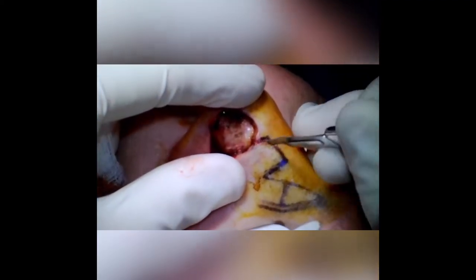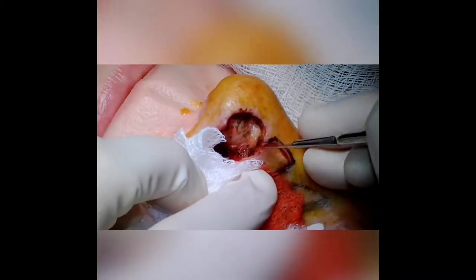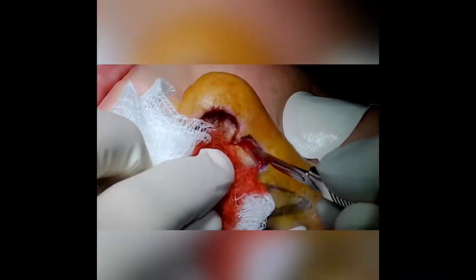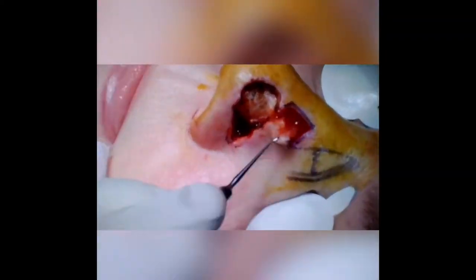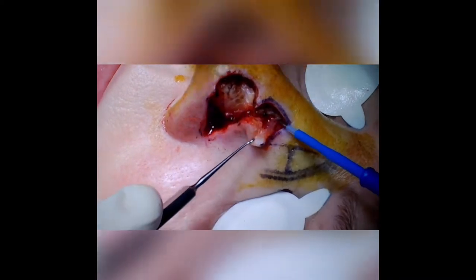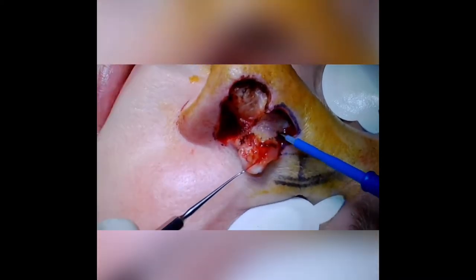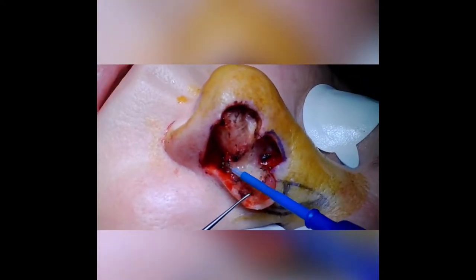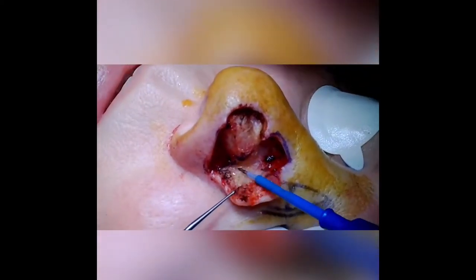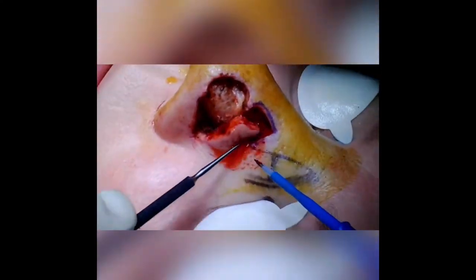Next we'll incise the first lobe, and I always raise these flaps in a sub-fascial plane. I'm going through skin, subcutaneous fat, and also the muscle, and we'll elevate this with cautery in a sub-fascial plane. It's a pretty easy plane, shouldn't be much bleeding. When I elevate in this plane you get better movement with less tension, and you can always thin the flap after you've raised it.